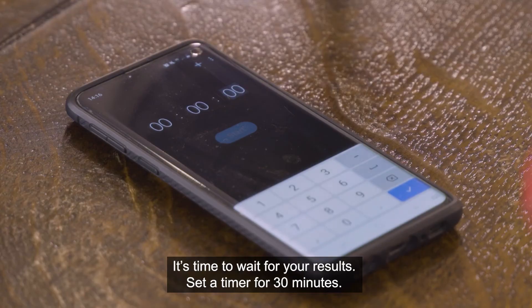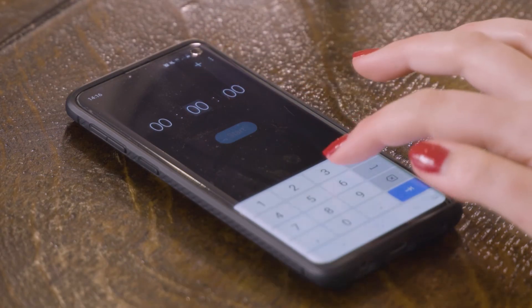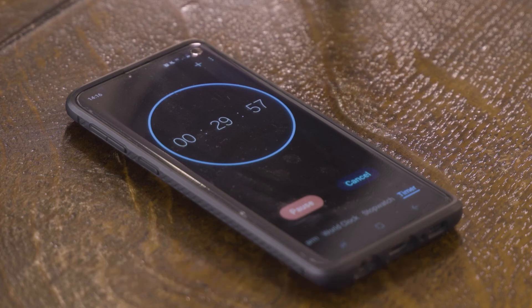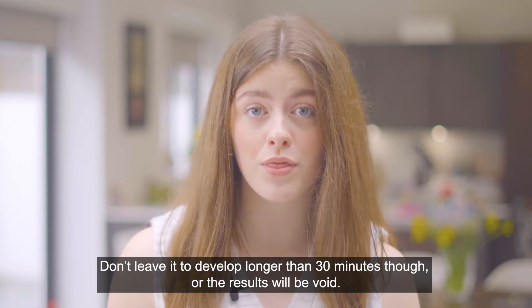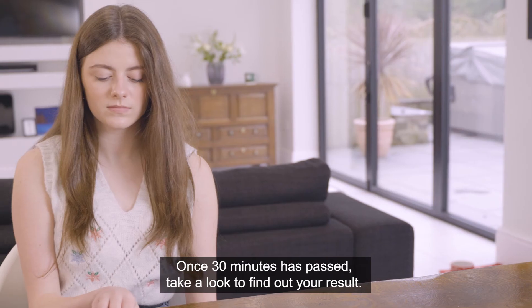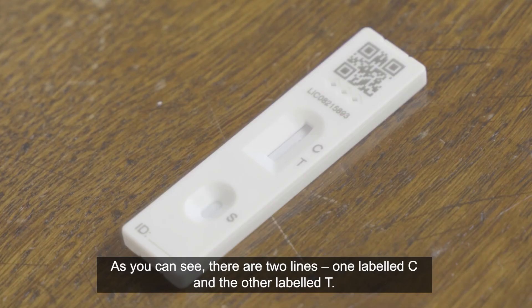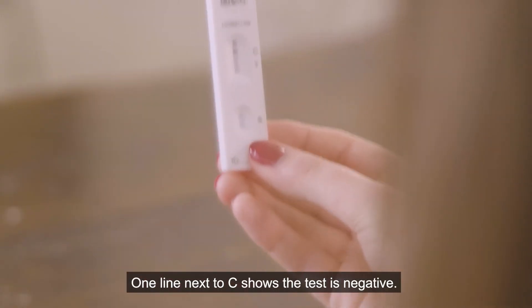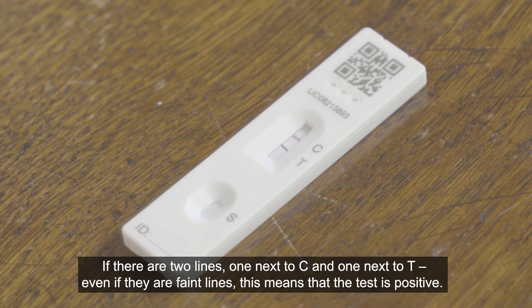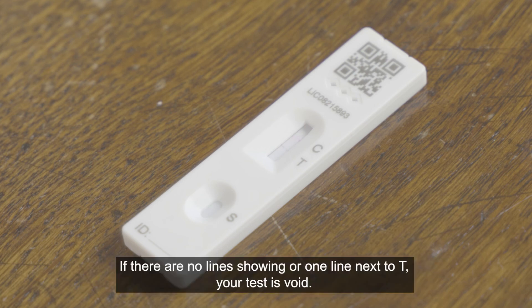It's time to wait for your results. Set a timer for 30 minutes. It's really important to wait the full 30 minutes before you read your result as they may vary before this. Don't leave it to develop longer than 30 minutes though or the results will be void. Once 30 minutes has passed, take a look to find out your result. There are two lines, one labelled C and the other labelled T. One line next to C shows the test is negative. If there are two lines — one next to C and one next to T, even if they are faint lines — the test is positive. If there are no lines showing, or one line next to T, your test is void.